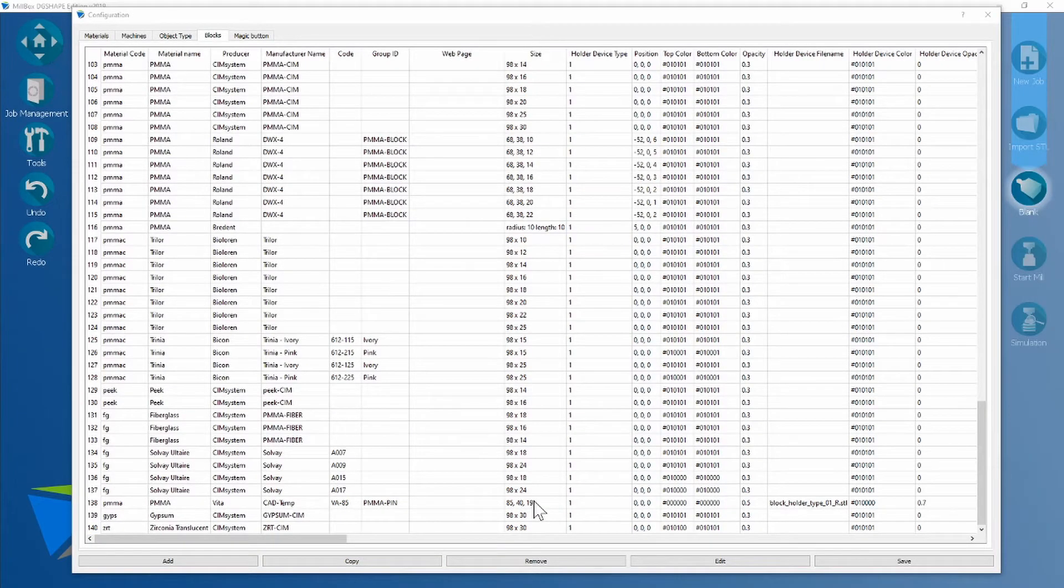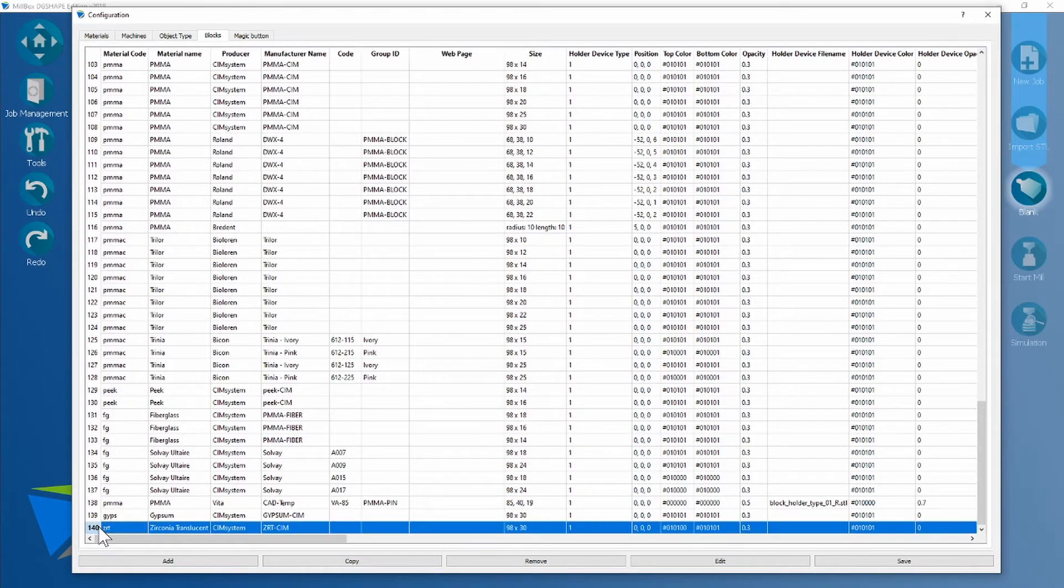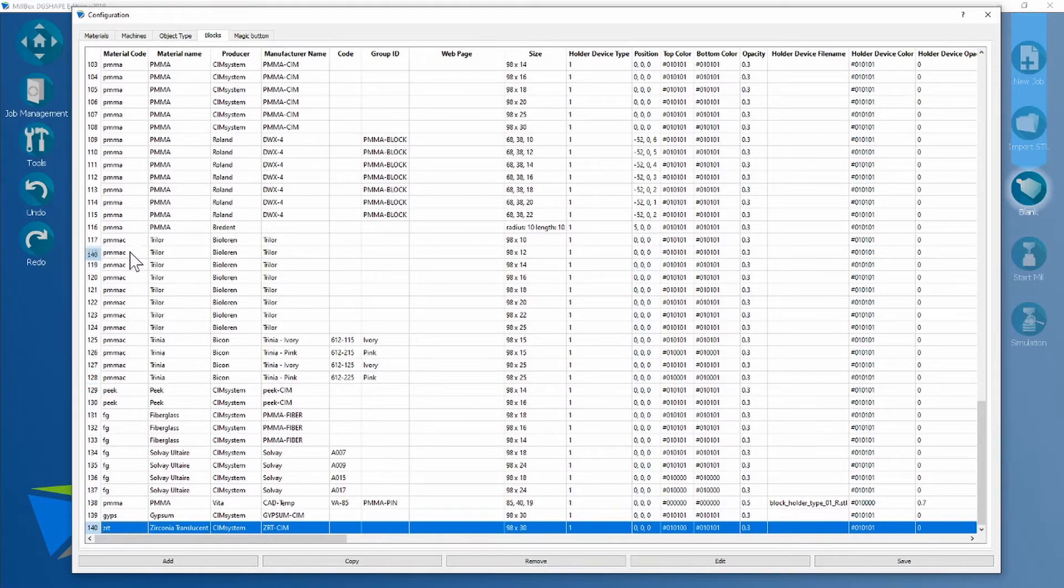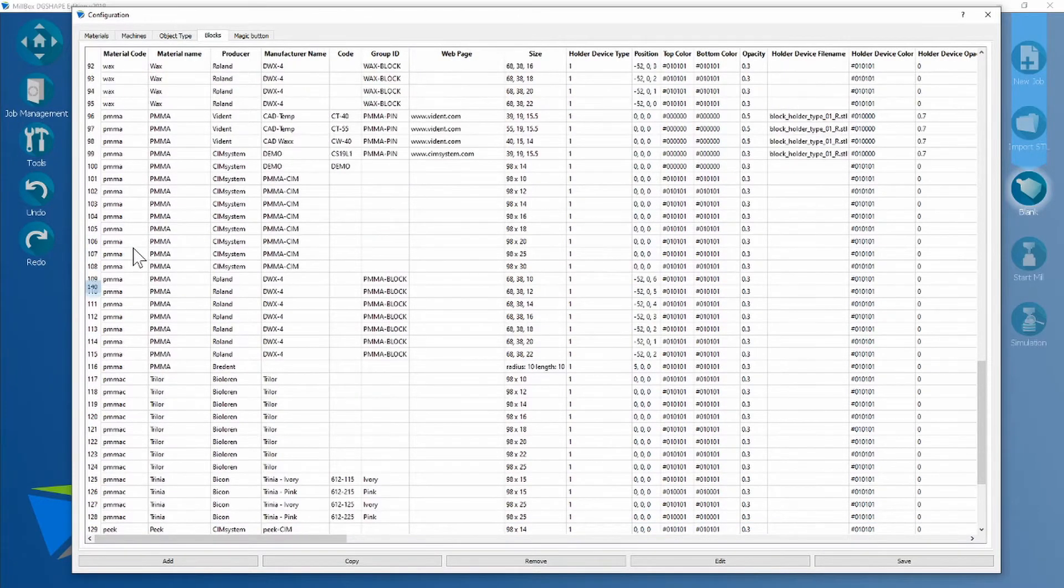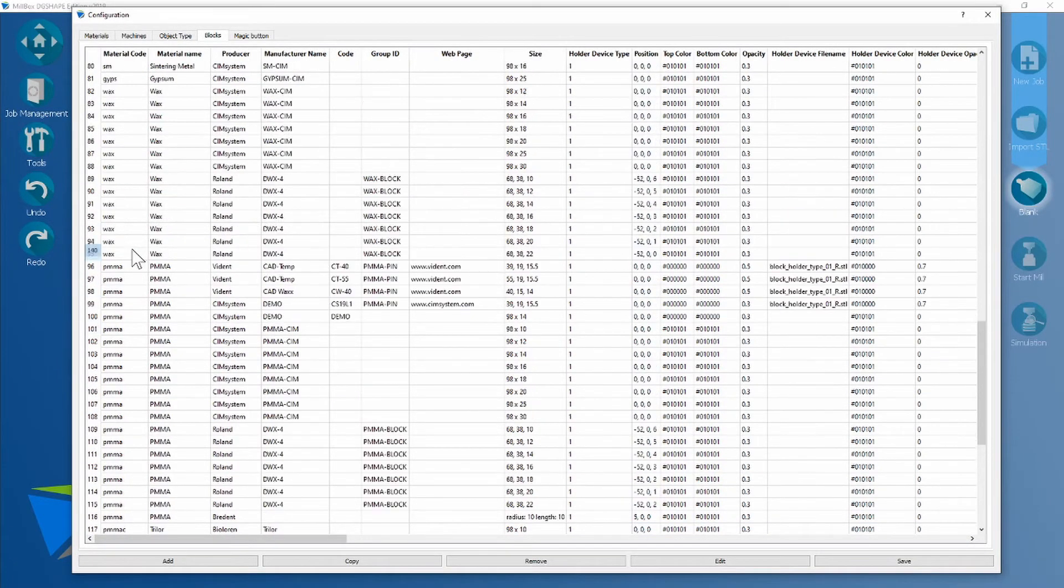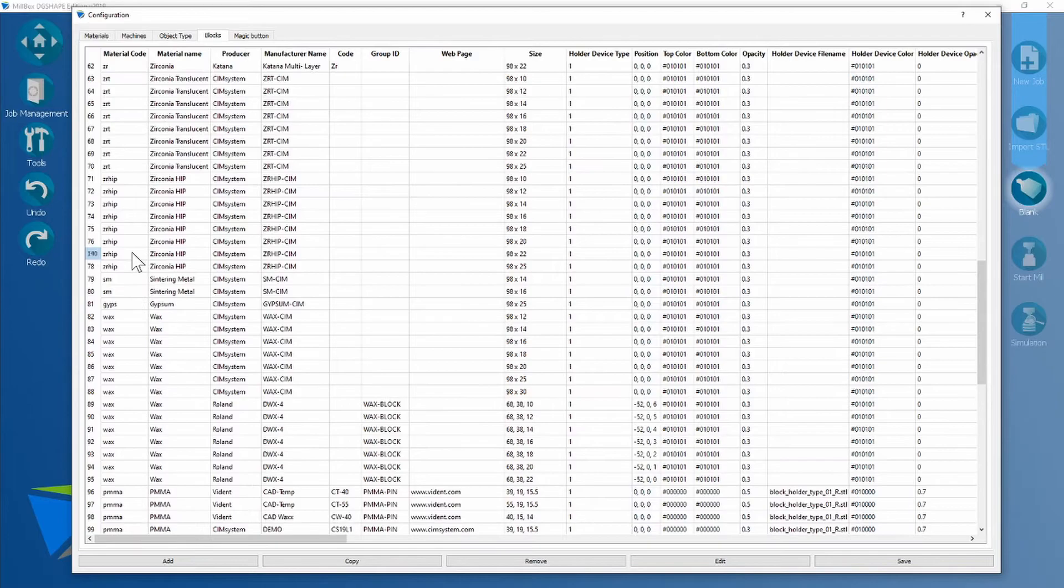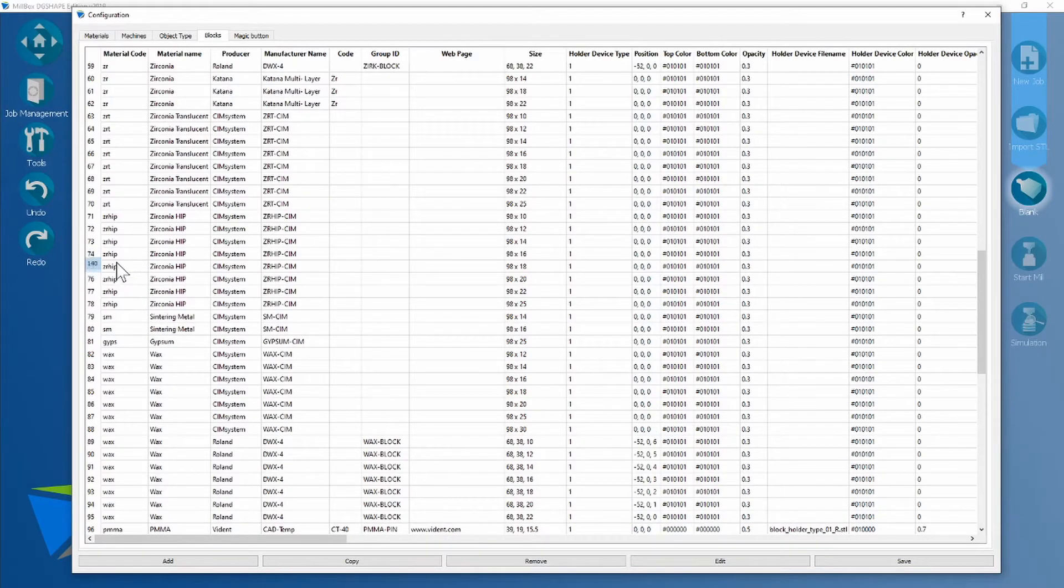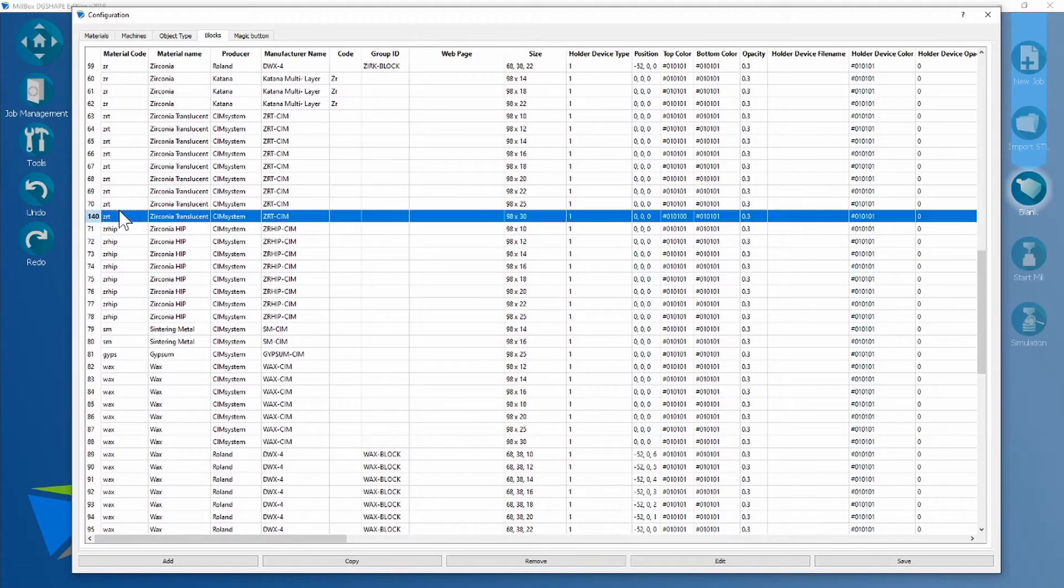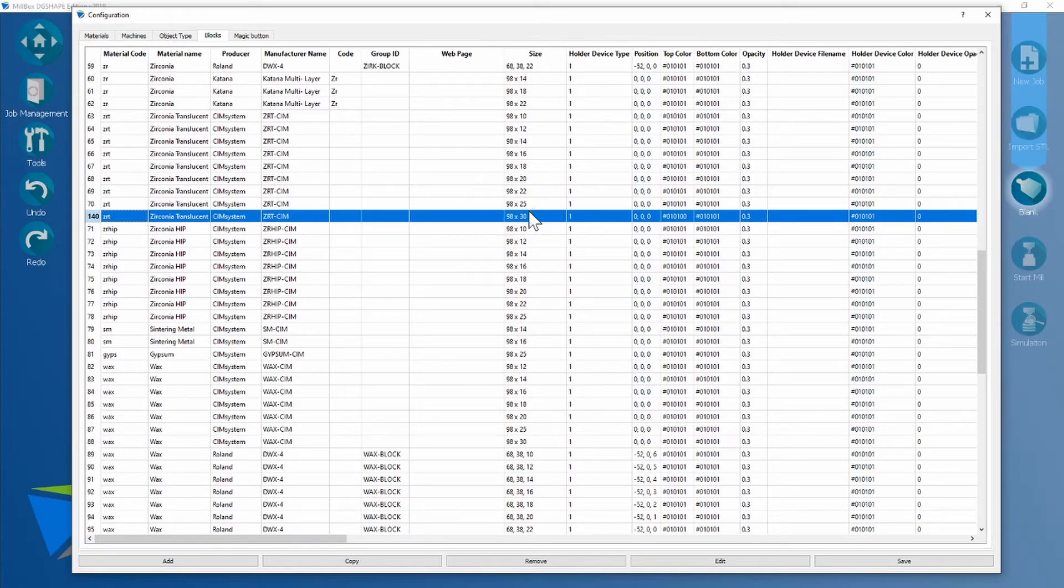Once you've clicked OK, you're going to find the new disk you've created. You're going to click it and drag it to where it needs to be. So we're going to find that ZRT-CIM again, which is here. You're going to drop this in the location that it needs to be in, 25 and 30.